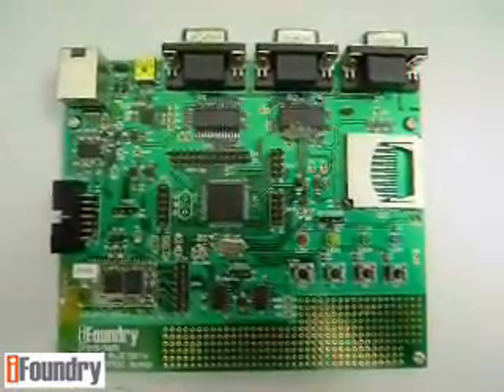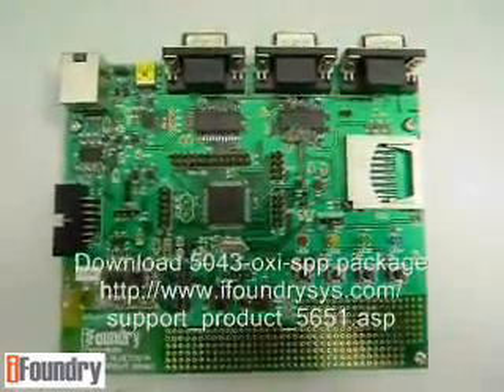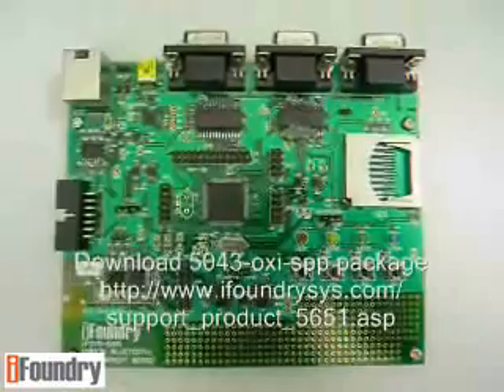There are a few things that you need to prepare. Firstly, you need to download the 5043 OxySPP package from the link shown on the screen. In this package, you will find the firmware and software components required to do this demo.